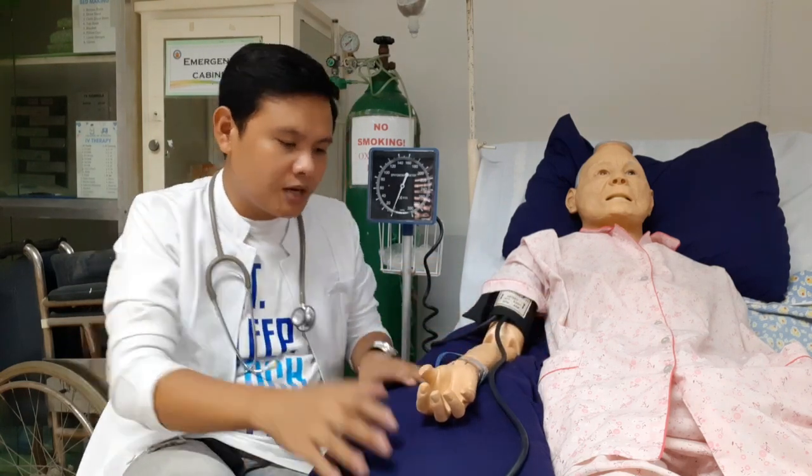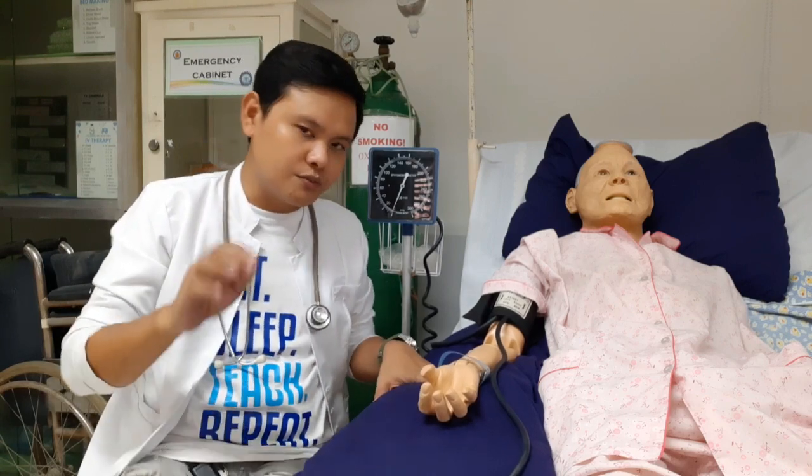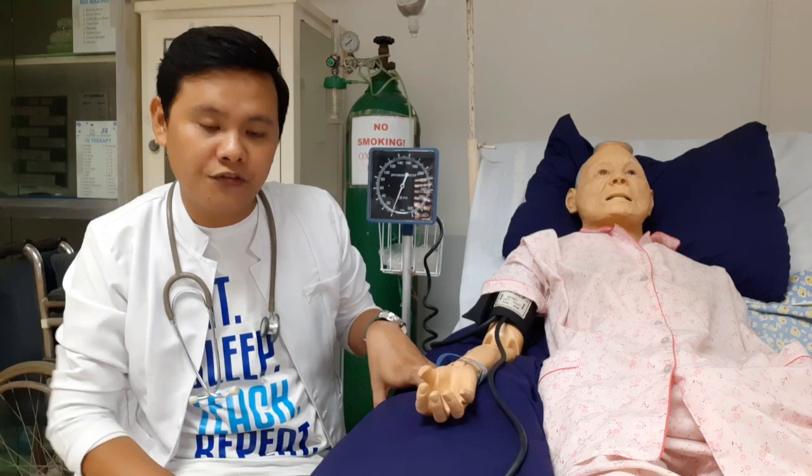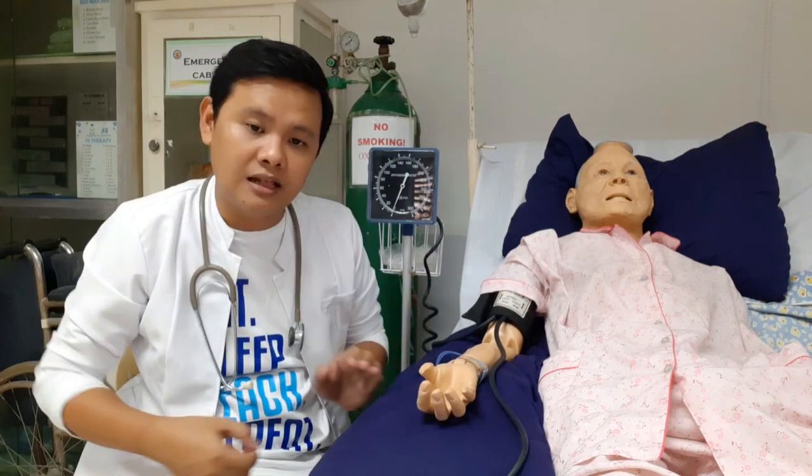So, paano sir, pagka wala pong ganito occlusion, wala pong pang support, isa sa ginagawa ko in a hospital is, I use my thigh. Ginagamit ko po yung thigh ko, pinapatong ko yung kamay ng pasyente ko dun sa may thigh, nang sa ganun, at least kahit pa paano, naka-heart level. Nang sa ganun, accurate yung data na makukuha natin.